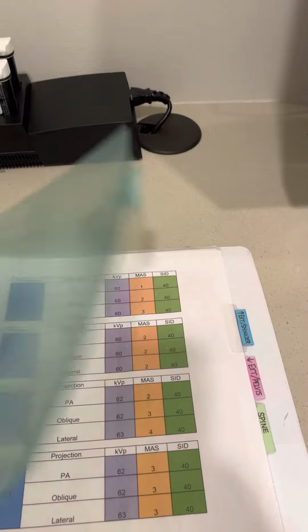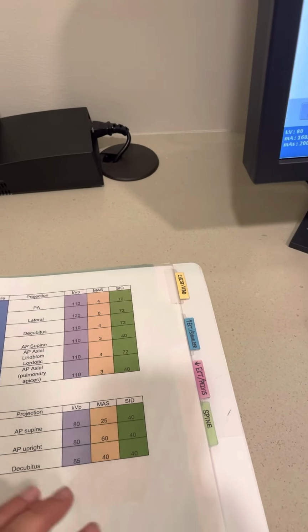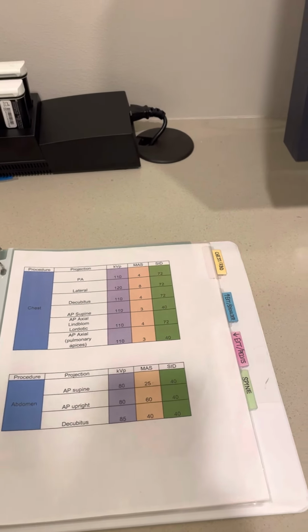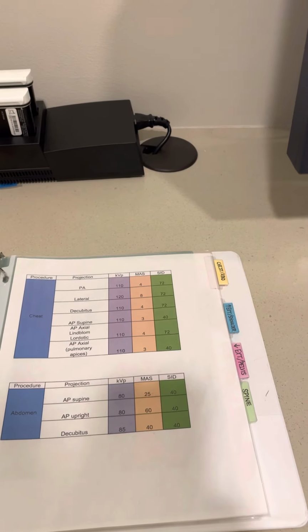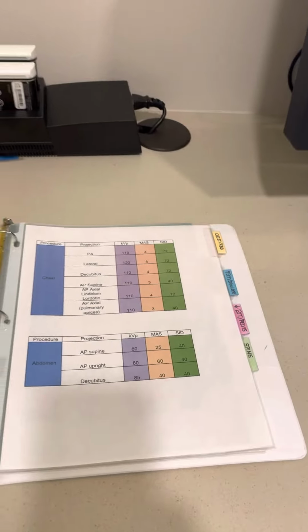And each section of the body is divided or listed so that all of the practicums that we have here in the lab, you can find the projection that you need and set your technique. You never have to memorize the technique chart.